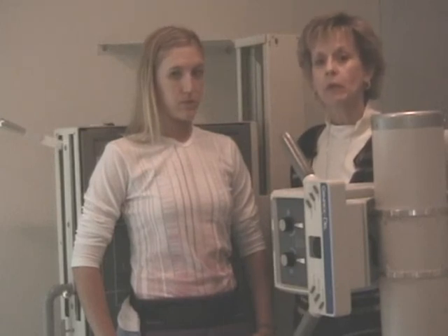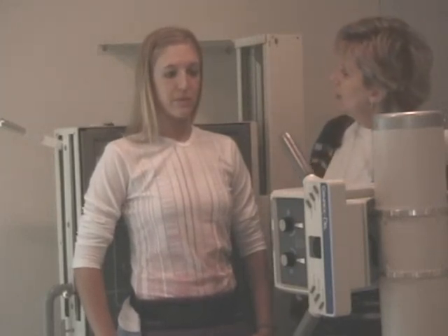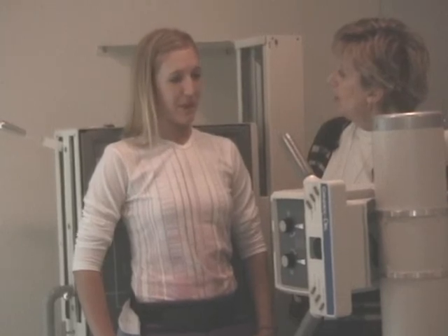But once in a while, if you have a broad patient, a tech will choose to turn the cassette crosswise for below diaphragm ribs. Kristen, you think you have anything to add, or were we pretty clear to the class?